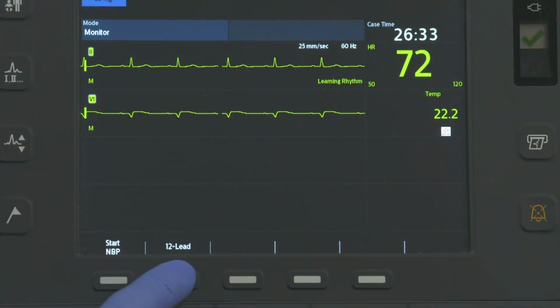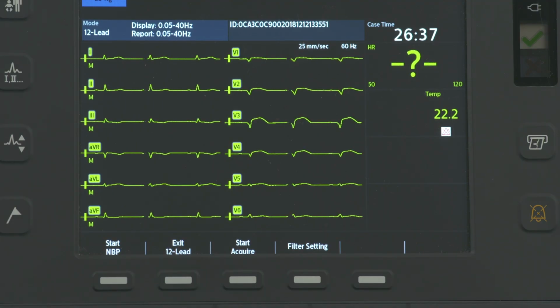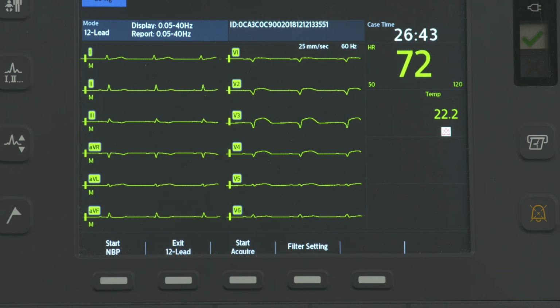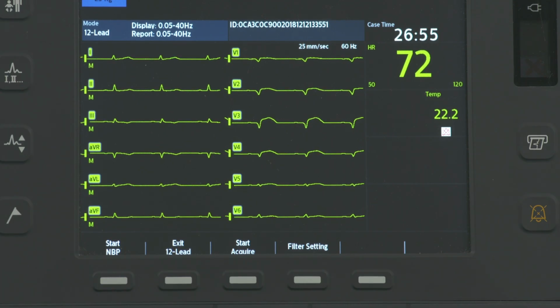In addition, the 12-lead function provides computerized ECG analysis using one of two acute myocardial infarction (AMI) detection settings for the DXL algorithm. The standard setting is the default setting and provides the standard Philips DXL algorithm acute MI sensitivity setting found in Philips patient monitors and cardiographs.